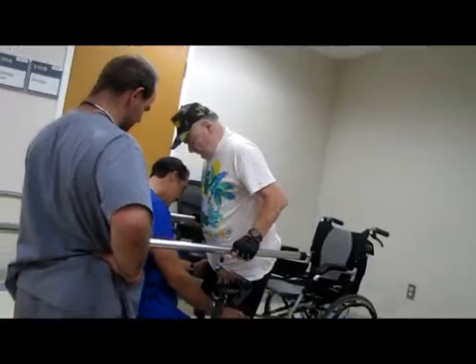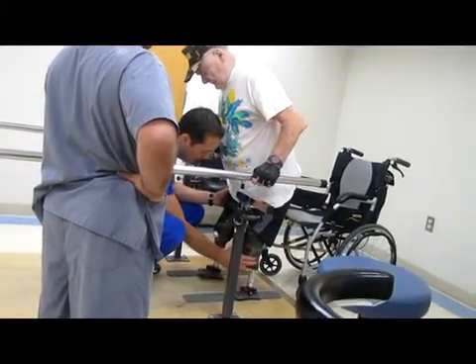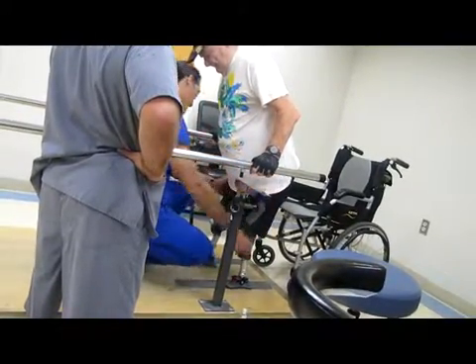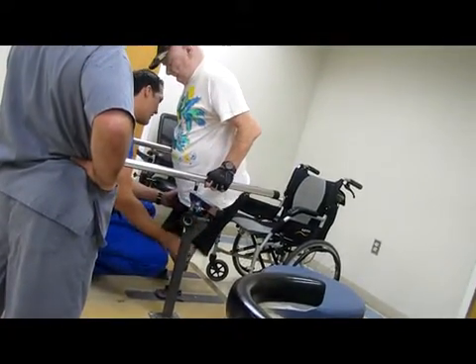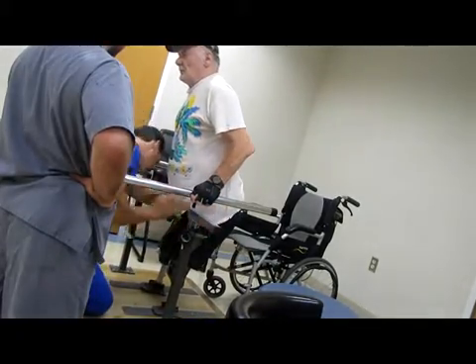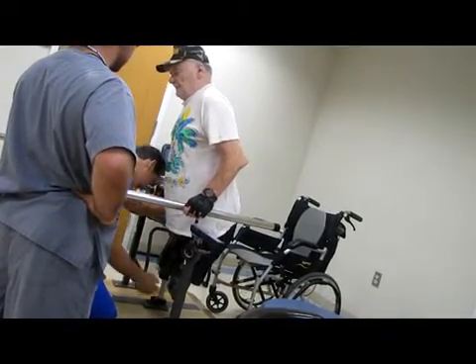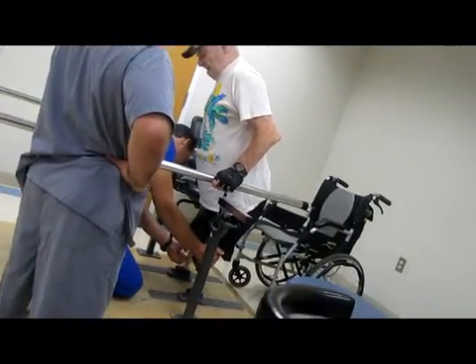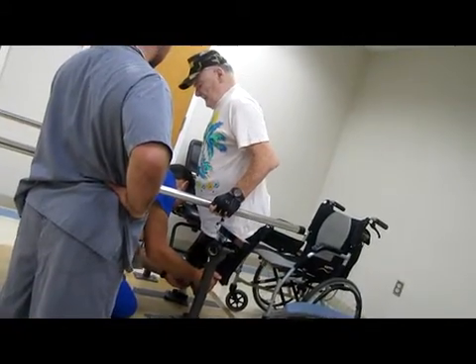Okay, let's just stand in place here and settle in. Can you bring your left leg closer forward? Okay, now let's just try to stand here. Look straight ahead in the mirror. Get your posture right. Suck your stomach in. I want to see how far down you are. Well, you're down in all the way. How's the comfort level? What do you feel?